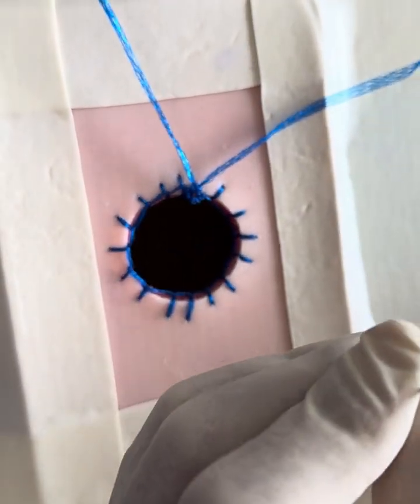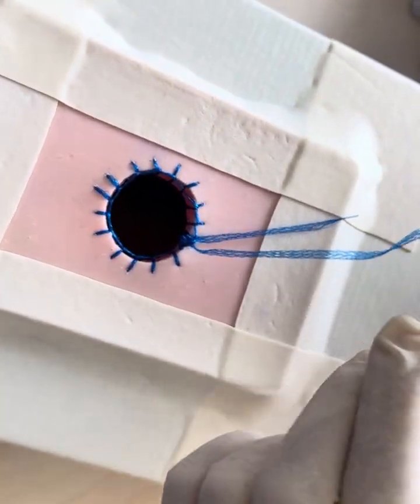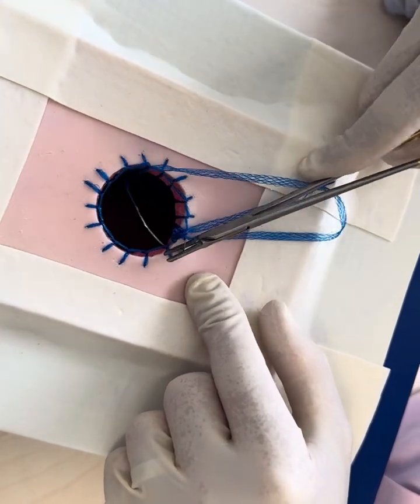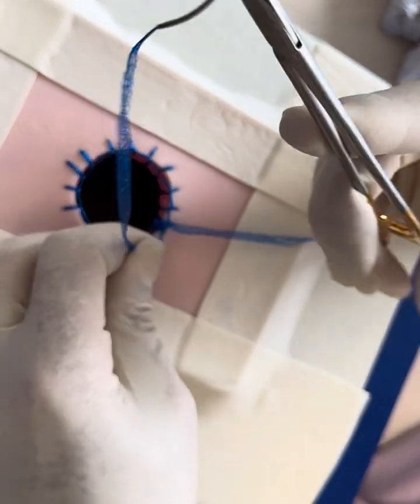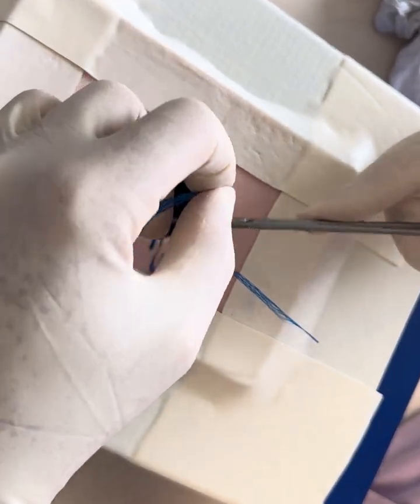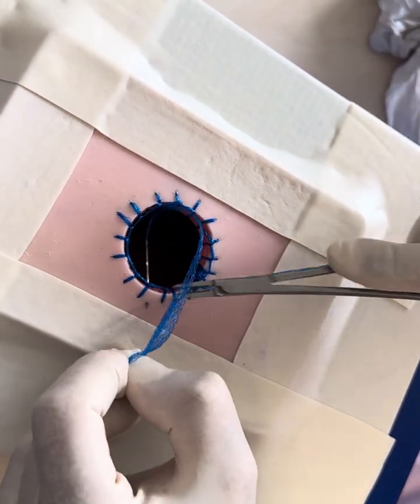Now, the bit of this repair that works well for parastomal hernias is that if we've had a big defect, or we've gone round once and we've closed it a little, you can keep on going round. My record to date is 6 times round. So what I would do then is take my next bite, coming between the last layer, but taking slightly bigger bite of tissue and coming back around and carrying on with the same mattress repair. In between the last 2, 1 so we don't pick up the Duramesh and lock it, and 2 so that we get more mesh into more tissue. And then we just keep on progressing around.